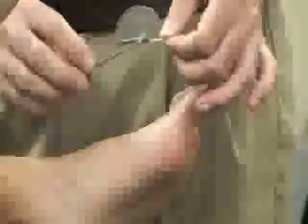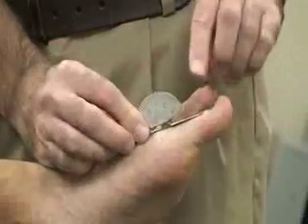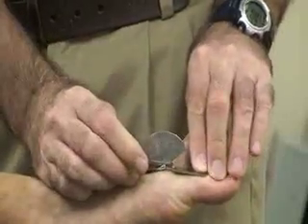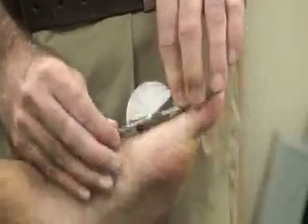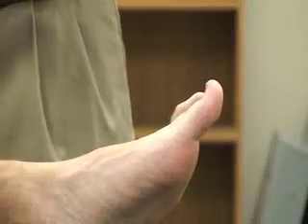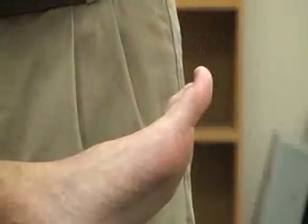Another method is to do it on the dorsal aspect of each digit using a dorsal goniometer. The fulcrum is going to be over the center of the metatarsal phalangeal joint on top. The stationary arm is going to be on the dorsal aspect of the metatarsal being tested, and the moving arm is going to be along the proximal phalanx for that digit. We're going to flex the toe as much as possible — same degrees as before: 45 degrees for the first toe and 40 degrees for digits 2 through 5.